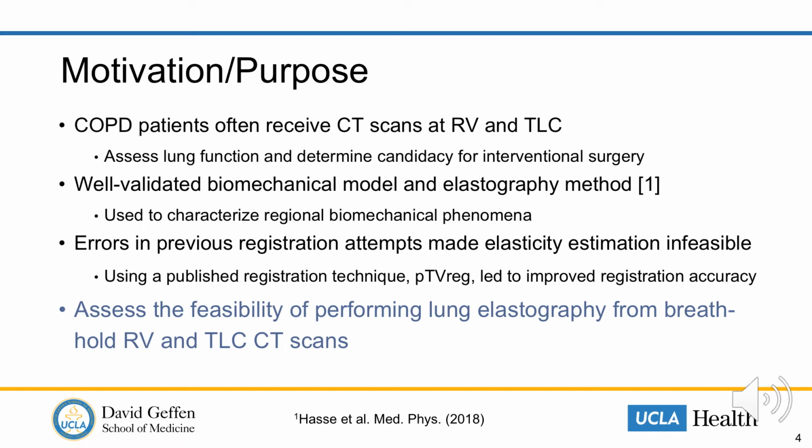High levels of error in previous registration attempts of large deformation image pairs have made performing accurate biomechanical model-based elasticity estimation infeasible. However, using a published registration technique, PTV-Reg, improved registration accuracy has been observed. Therefore, the purpose of this study is to assess the feasibility of performing lung elastography from breath hold, residual volume, and total lung capacity CT scans.